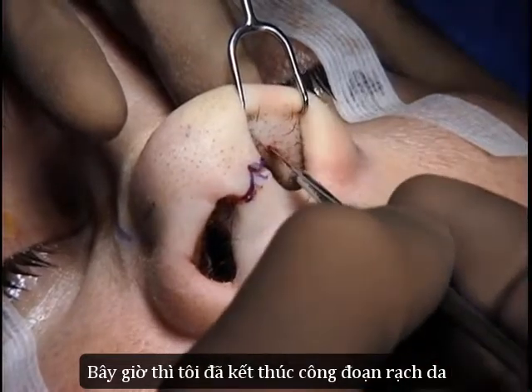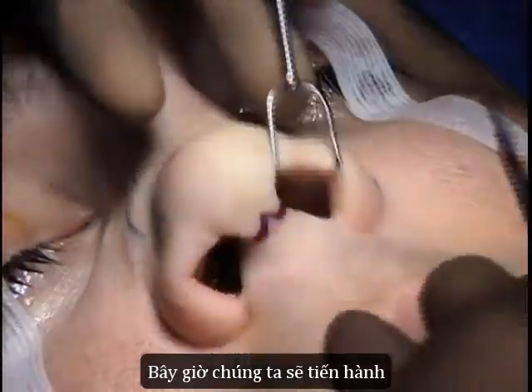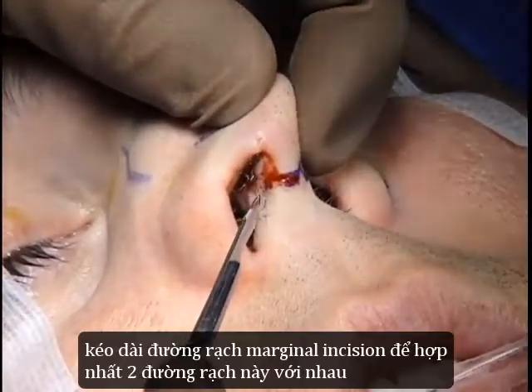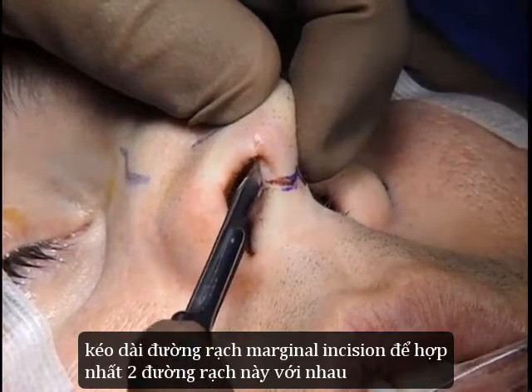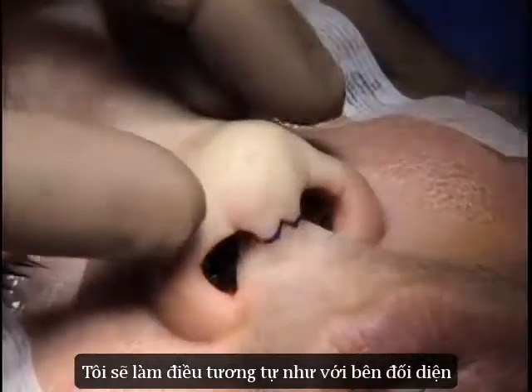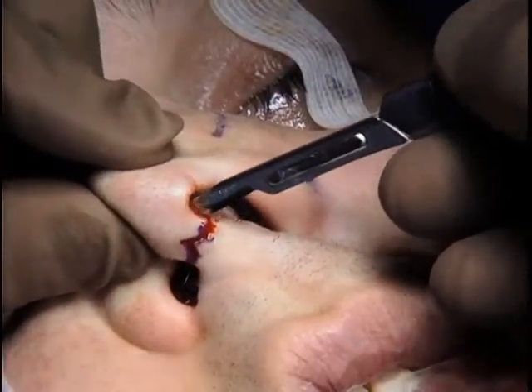Now we'll just complete that incision. Now we'll make the marginal columellar extension of the marginal incision. That's going to go right down here. And then the same thing on the contralateral side.